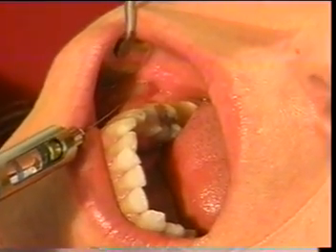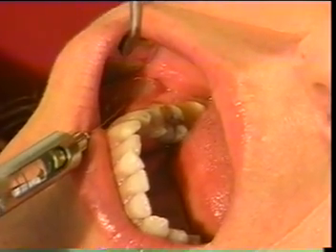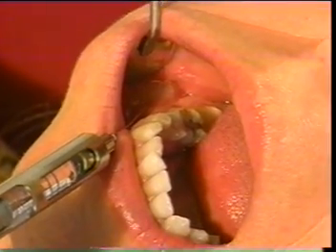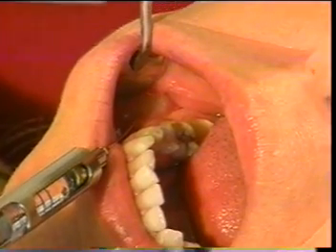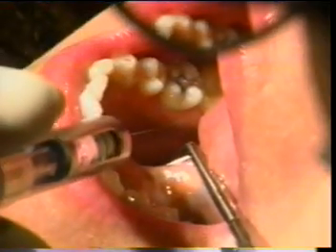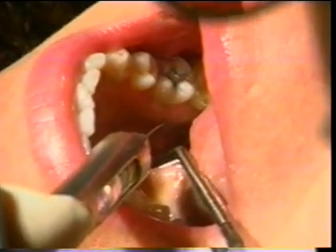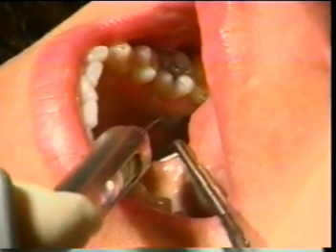Buccally, approximately 1 cc of anesthetic solution will now be delivered over a time period of 30 to 60 seconds. This will shortly be followed by the lingual infiltration. The lingual infiltration will have the needle tip enter just apical to the mucogingival line and rest subcutaneously, with the bevel facing the lingual alveolus at a depth of only two to three millimeters.